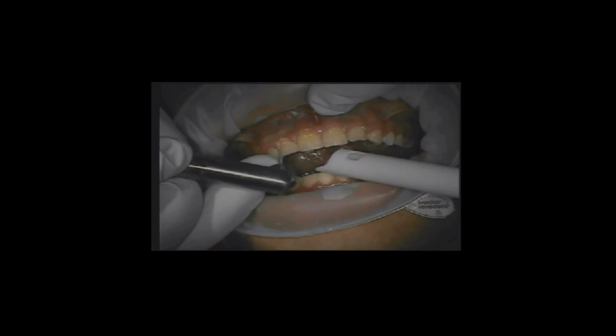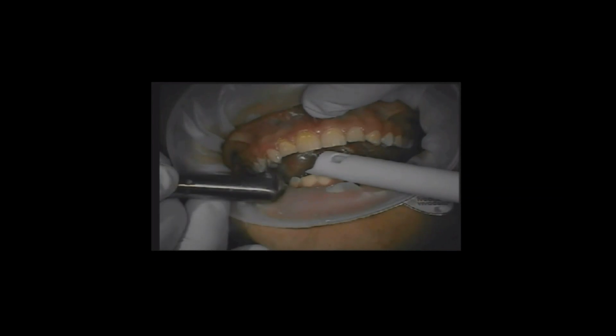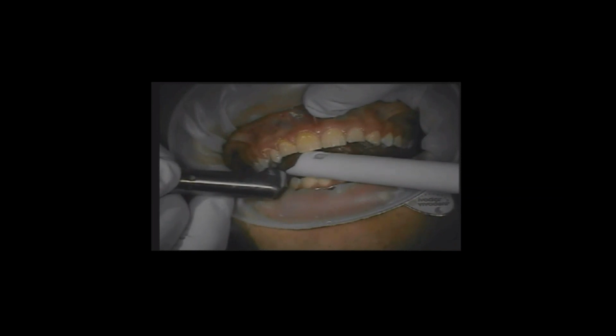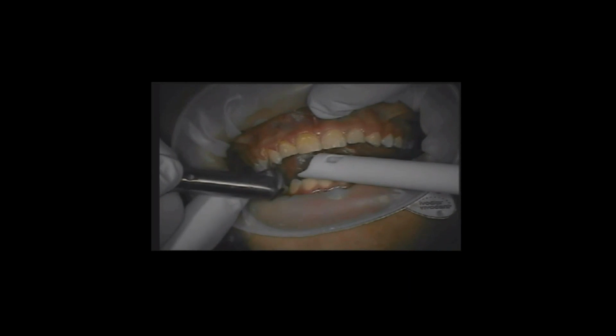And I'm doing that dry, as I said, because the cut is more efficient, so we can remove more tissue. Very, very light to no contact with the tissue. That way you don't start getting the tissue tags or the buildup on the end of your tip. And it actually will cut down on the tissue bleeding. One of the reasons that you get some bleeding is if you're taking a tip and you're dragging it on the tissue, you'll stimulate more bleeding when you're doing this.